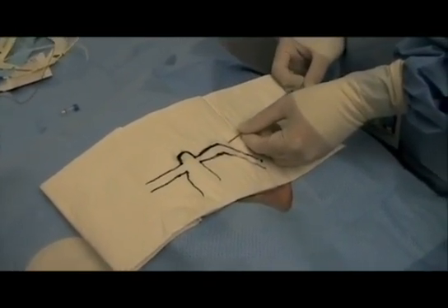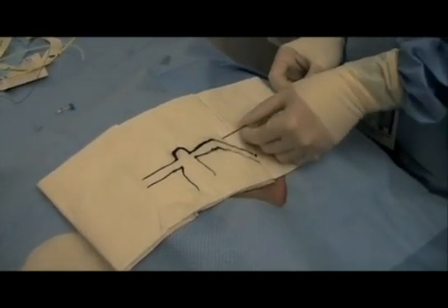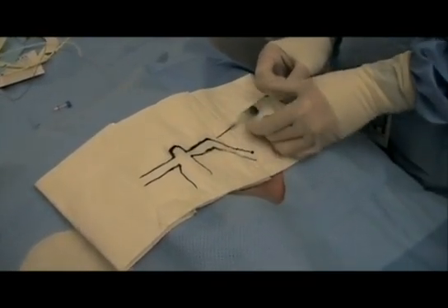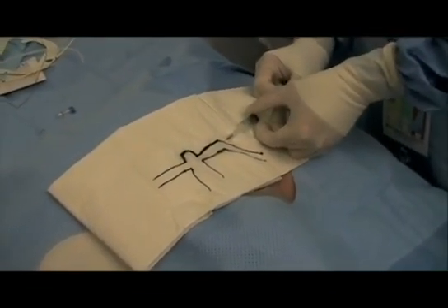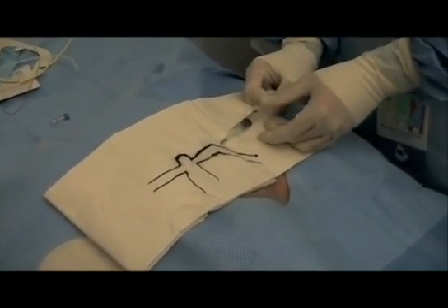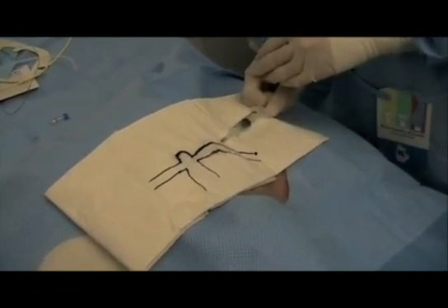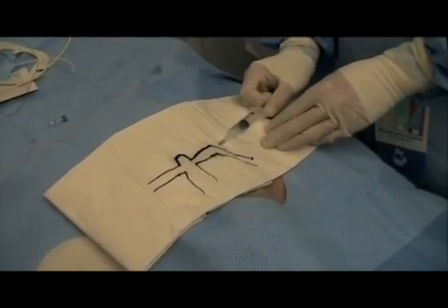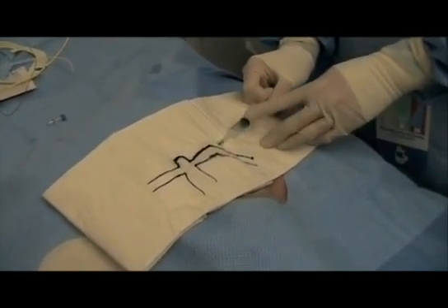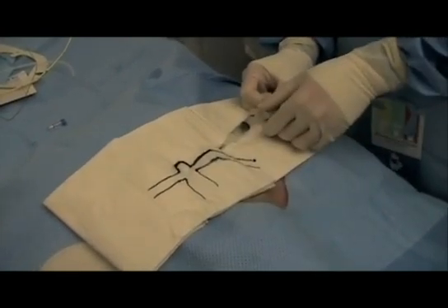What you're doing is putting negative pressure on the syringe the whole time and just going towards your sternal notch. Sometimes — and it's scary when you first start this — you do have to hub the needle in order to get your flash. That's acceptable for a subclavian through the infraclavicular site. You should never do that for an IJ because the IJ is just not that deep, but sometimes it will take this much depth of needle to get your flash.